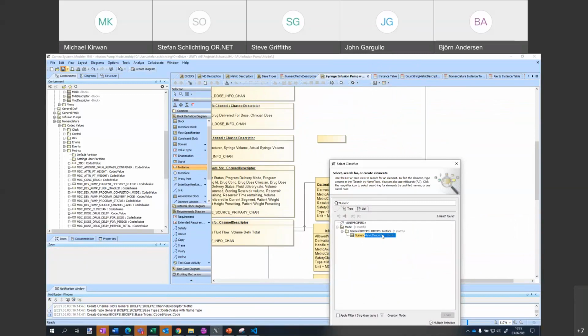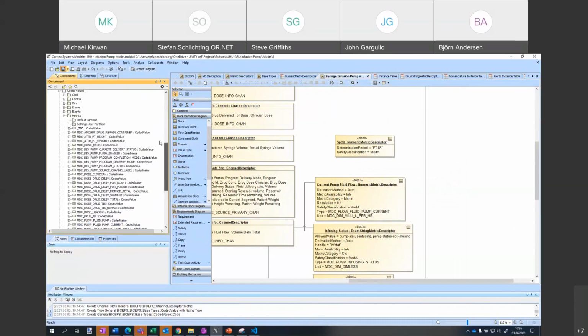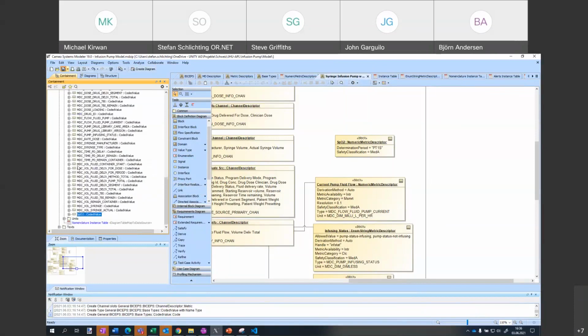Yeah, so I would add a new... Let's assume I have built up the channel or whatever for the monitor already. So I would create a new numeric metric descriptor, for example, for a measurement. Let's say SpO2. Of course, I don't have the nomenclature included. Well, can you just cut and paste the nomenclature or download it from somewhere? Yeah. Currently, the importer is still on my to-do list, so that it automatically imports it with all the attributes. Then you can just edit. Those are the attributes for the infusion pump, right? But you could delete those or keep those and then import other metrics for the vital signs monitor. I see. Yeah, whatever it needs to be.